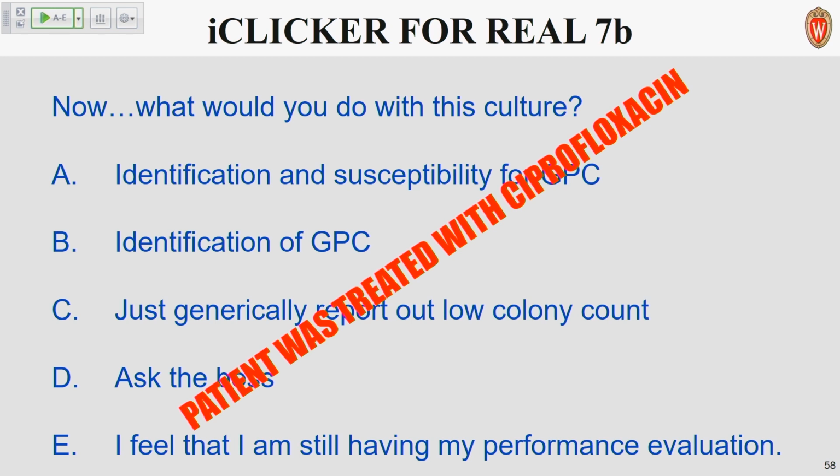So I have a question based on something we've done in the last year or so. Apparently our pharmacists have said that even if we have a pure culture of over 100,000 coag negative staph, we should not be doing identification and susceptibility on it, which quite a few of us feel heebie-jeebie about.